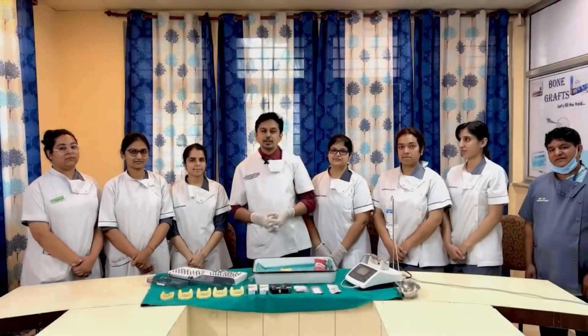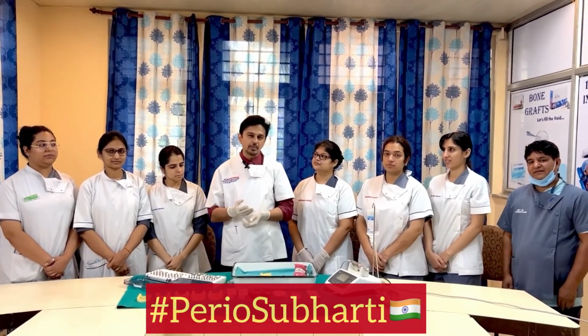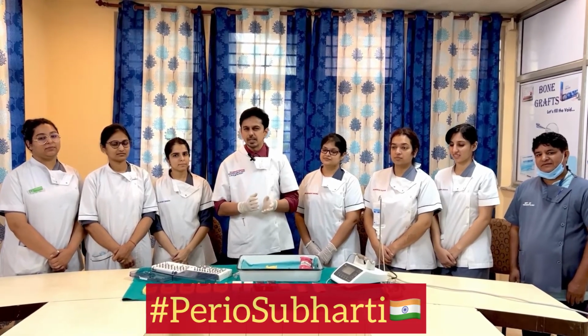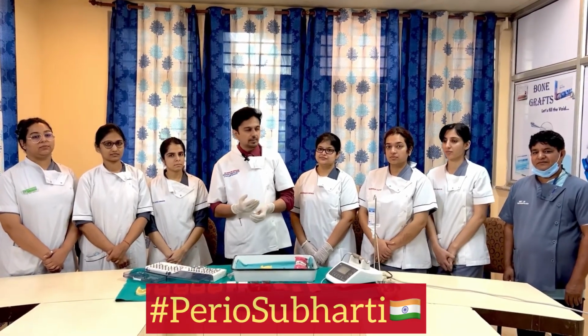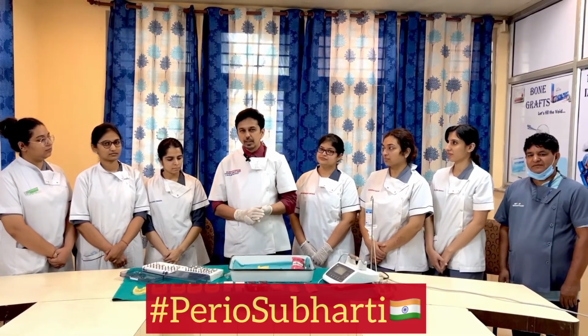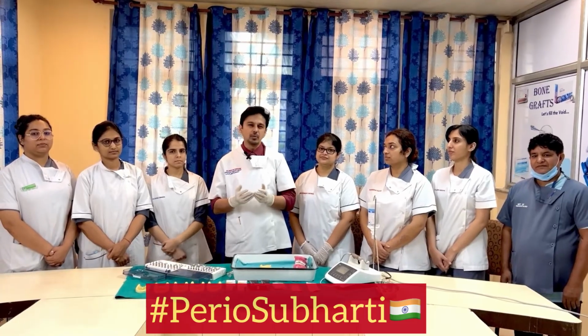Is it fine? So this was just a brief overview of hands-on of implant placement in artificial mandible. So we covered up the basic principles, the demonstration part. Few things vary according to the kit which we are using. So now we will be starting with the hands-on, in which all of you would be placing it in the mandible. We hope that by our small demonstration, few basic things we were able to make it clear.